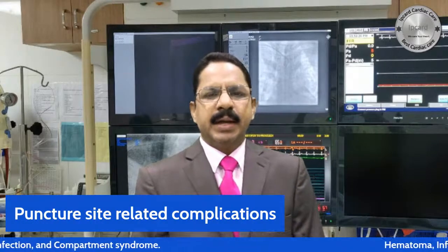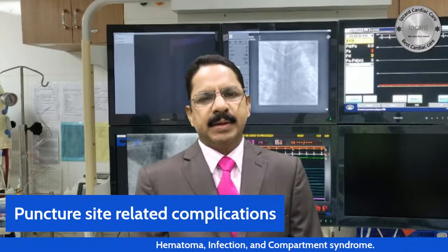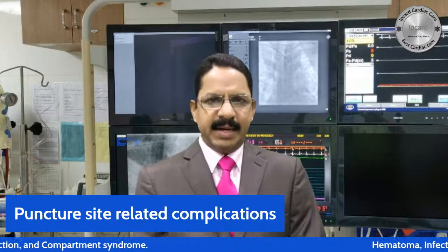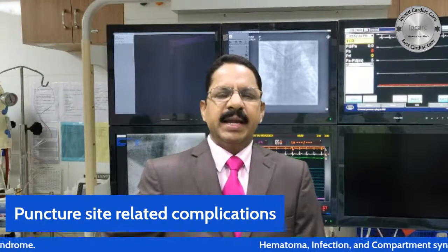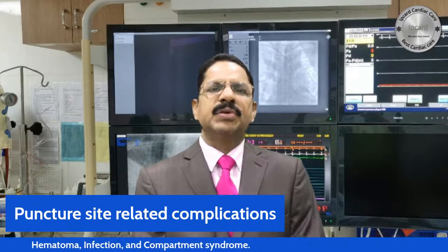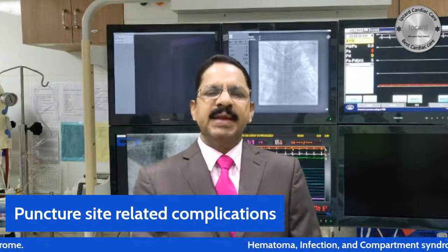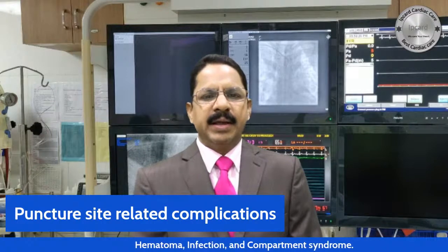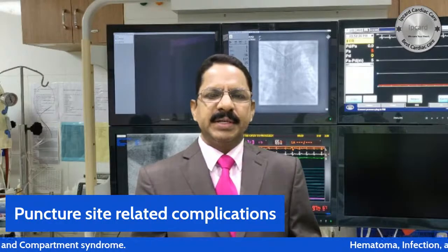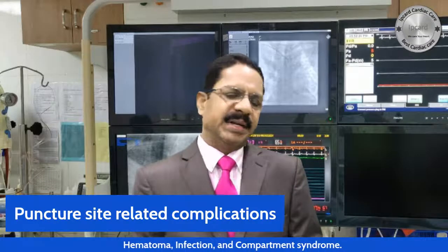For the puncture site, we actually do angiography through four major vessels. Firstly, we prefer the right hand radial artery. The same way, the right leg femoral artery. If the right hand radial artery is not palpable and healthy, then we prefer the left hand radial artery. If the left hand radial artery is not good and healthy, we go with the left leg femoral artery. These four major artery segments are very important for angiography and catheter related procedures, including percutaneous coronary interventions.